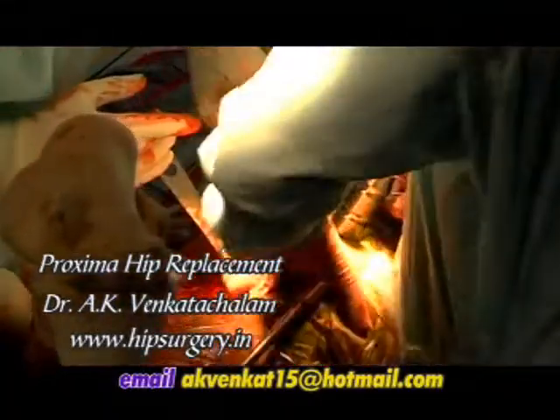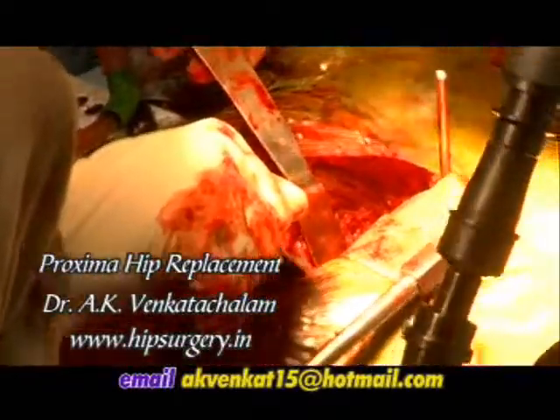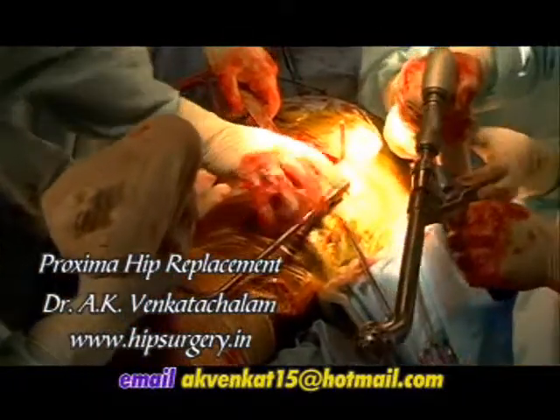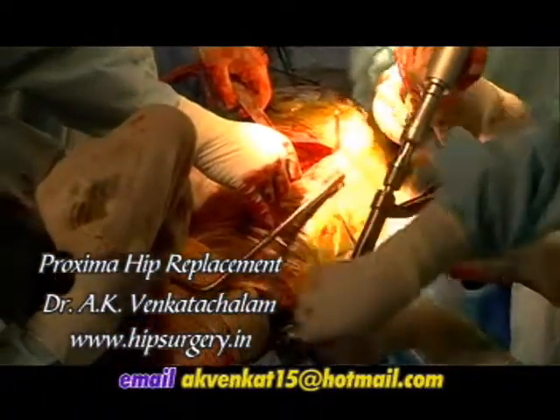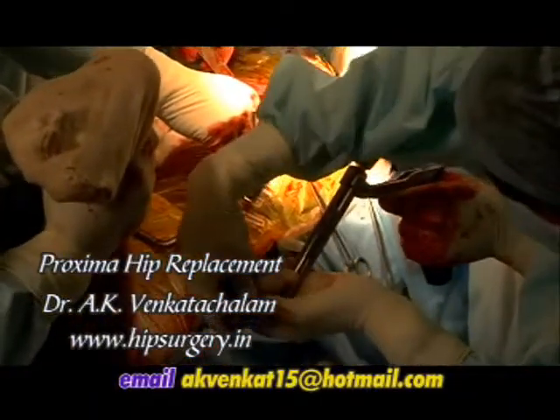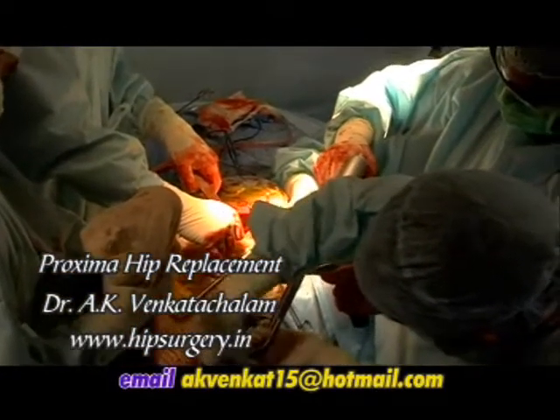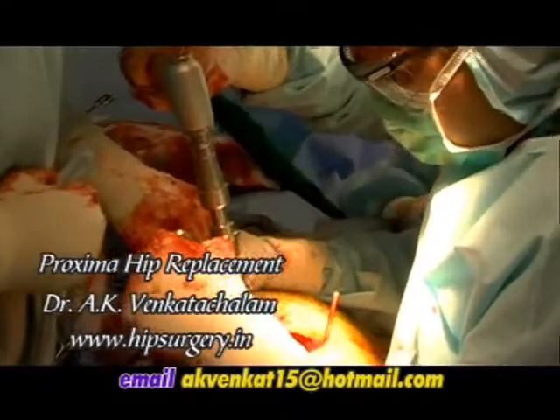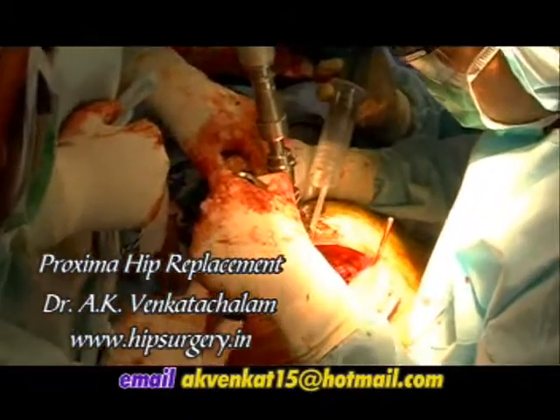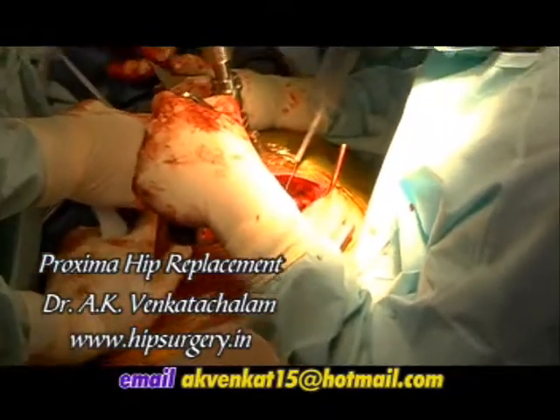After thorough exposure of the acetabulum, it is reamed with sequential reamers. The key points in acetabular reaming are to create a hemispherical cavity with uniform bone-implant contact, an adequate press fit for initial stability, and placement of the prosthesis at the anatomic center of rotation of the hip joint. A reamer 6-8 mm smaller than the anticipated acetabular component should be chosen initially to deepen the acetabulum to the level determined by pre-operative templating.